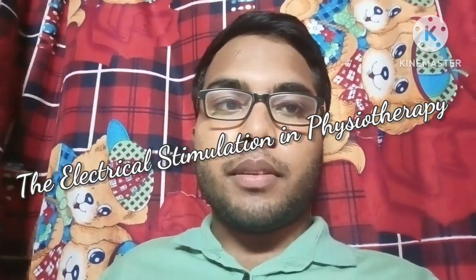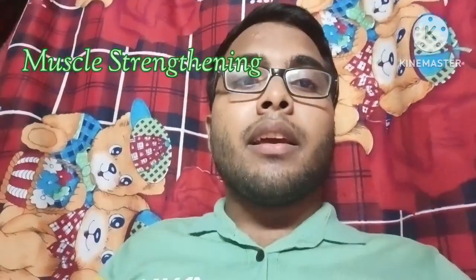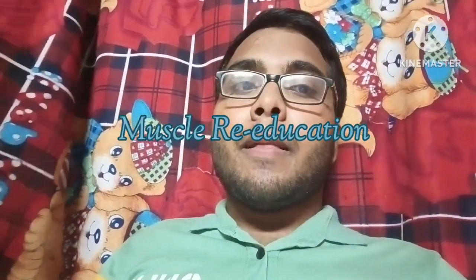Hello viewers, today we will learn how we use electrical stimulation in physiotherapy. So let's start. We, as physiotherapists, apply suitably modified electrical current through electrodes placed on the skin to stimulate excitable tissues like nerves and muscles to produce therapeutic benefits like muscle strengthening, muscle re-education, pain relief, and many more.